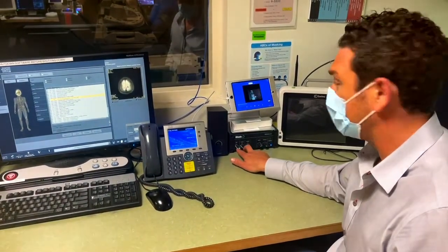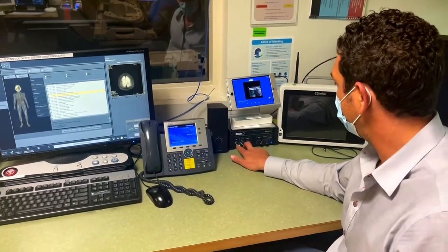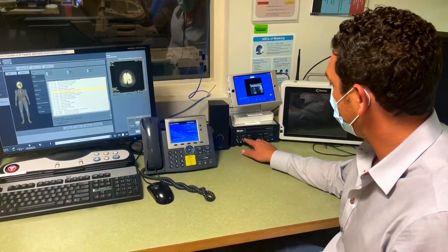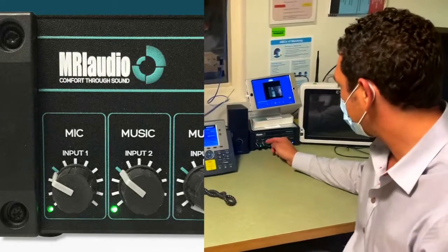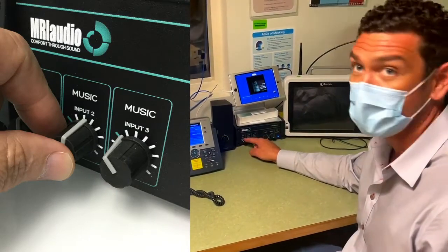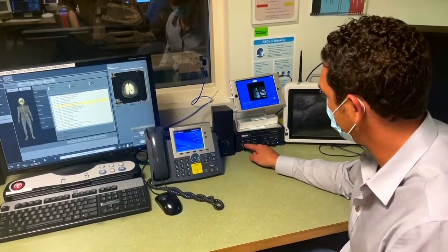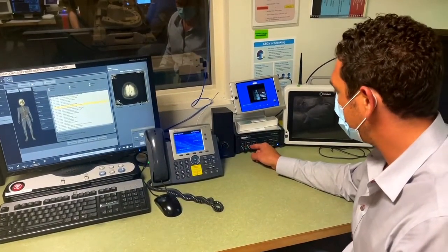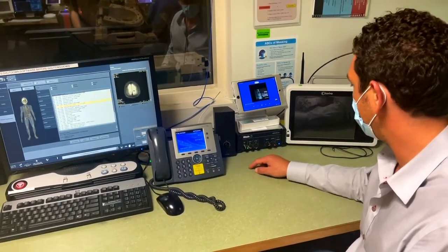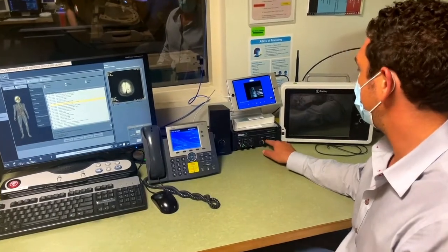The primary two volume controls you're going to use are microphone volume and music volume. You can adjust the microphone and music volume independently of one another. This can be useful if you want to make sure the patient can clearly hear your voice commands and auto voice, which is channeled through the MRI audio system, but they don't want to listen to music too loud. In this situation, you would turn the music volume down and the microphone volume up. You can also adjust bass and treble.